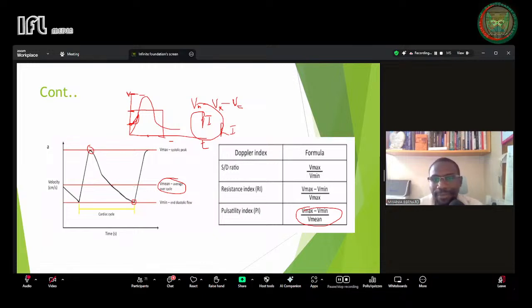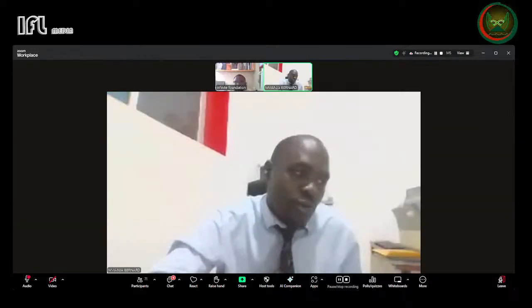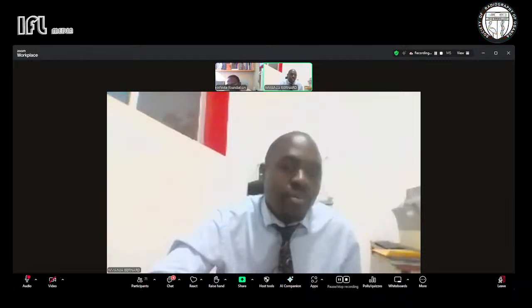Yeah, thank you, Mr. Lukenge. Amina, your question here, when you are talking about MCA, you did say that when I'm doing MCA, high resistance means normal and low resistance means abnormal.